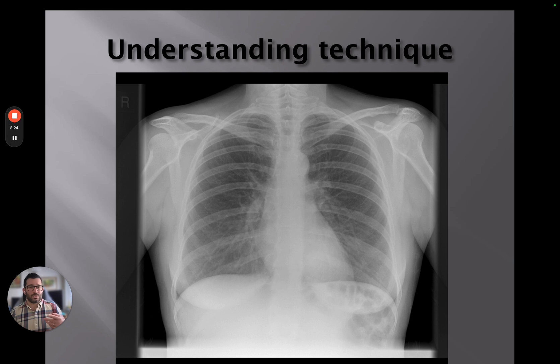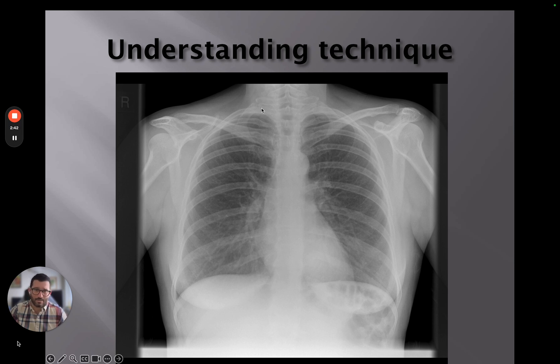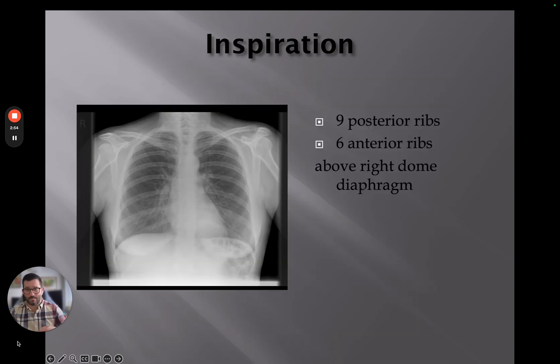We're seeing a lot of interposition of anatomy on top of each other, and we need to appreciate what we're looking at and what that means for the patient. For the anterior ribs, we can count them here: one, two, three, four, five, six — and possibly a seventh. The posterior ribs are these more horizontally oriented ribs coming away from the spine: one, two, three, four, five, six, seven, eight, nine, ten. We can infer that this patient has taken a very good inspiration.